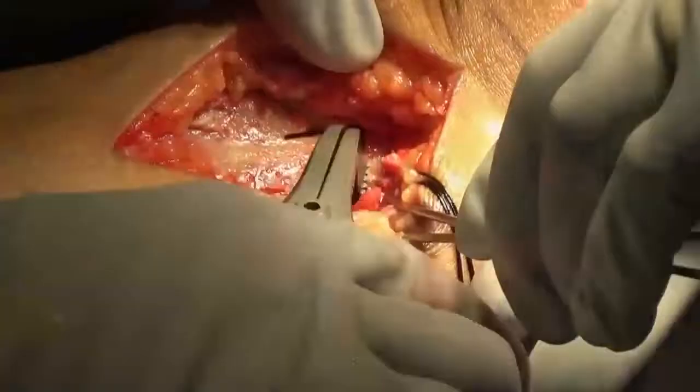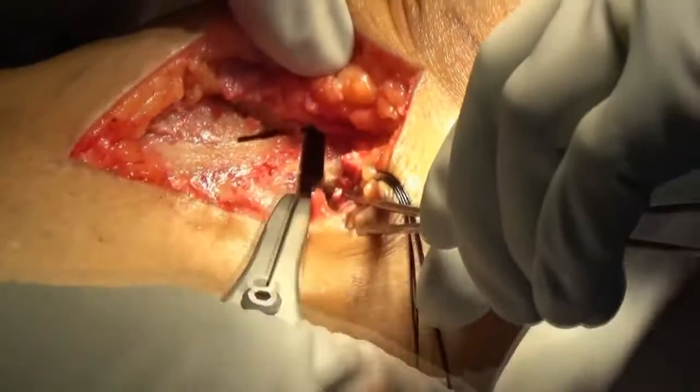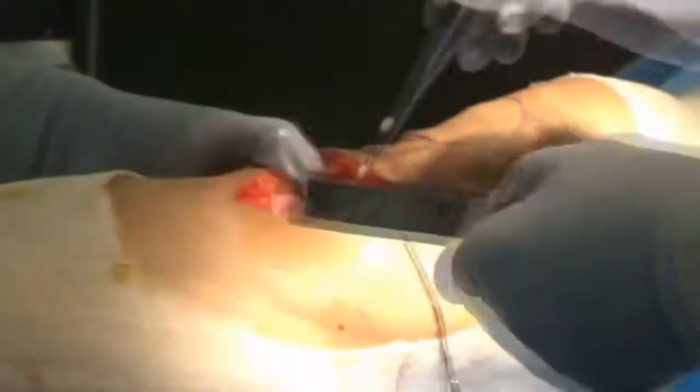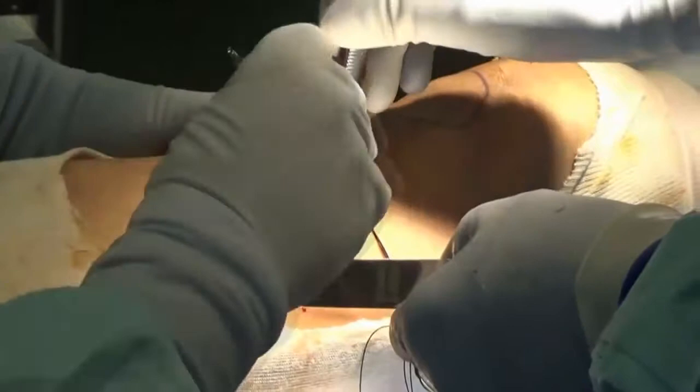The transverse osteotomy site is then opened using a bone spreader until ideal correction is achieved. Beta-TCP is usually inserted for patients requiring larger correction. The harvested osteophytes are inserted into the empty osteotomy space.